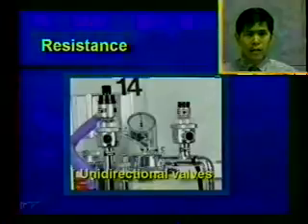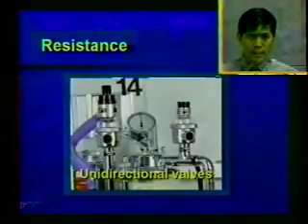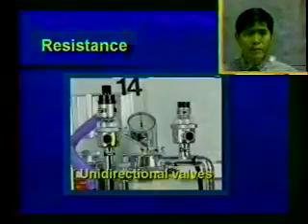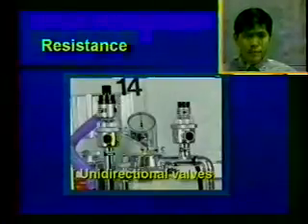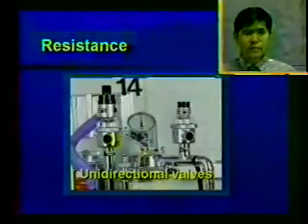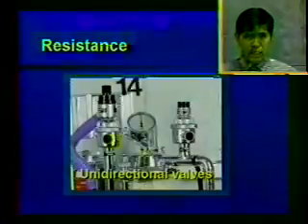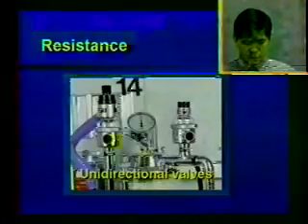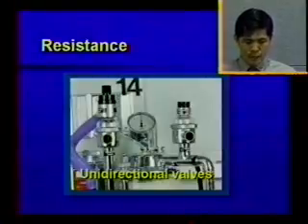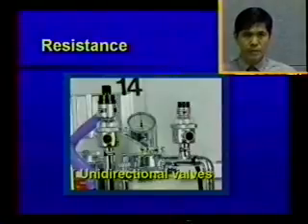The unidirectional valves provide the resistance to breathing. And why is that important? Well, if you have a very small animal, and that animal has to breathe through this resistance, that animal, over time, will have difficulty breathing. There will be some fatigue. That animal will have less energy to breathe and actually will develop hypercapnia as a result of the resistance. So again, we use the circle breathing systems for animals greater than 10 kilograms, and we use the non-rebreathing systems for patients less than 7 to 10 kilograms.